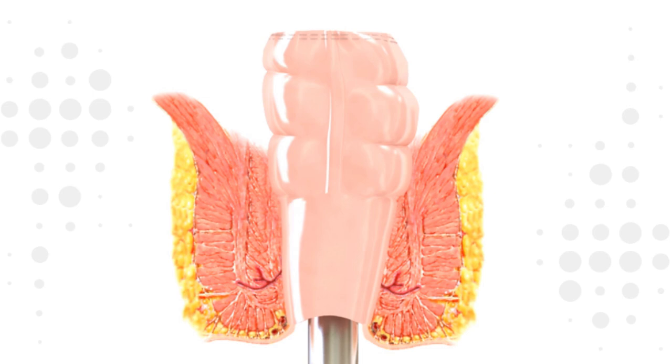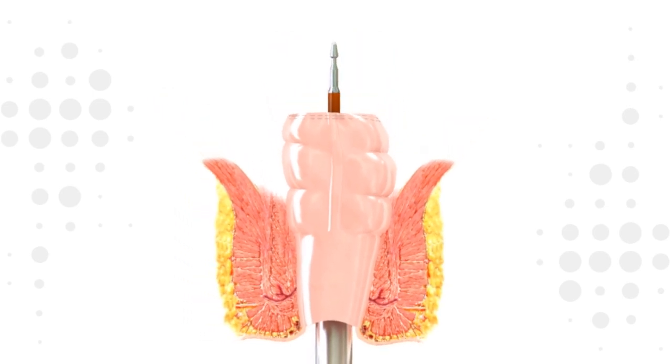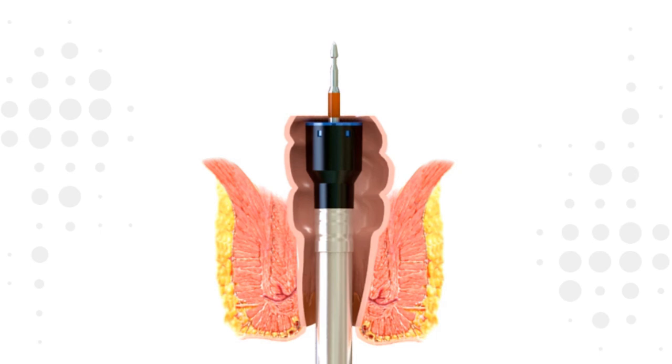Fully extend the trocar and pierce the tissue. Ensure that the orange tying area is visible. Attach the anvil to the extended trocar. An audible click should be heard when the anvil snaps into its fully seated position.